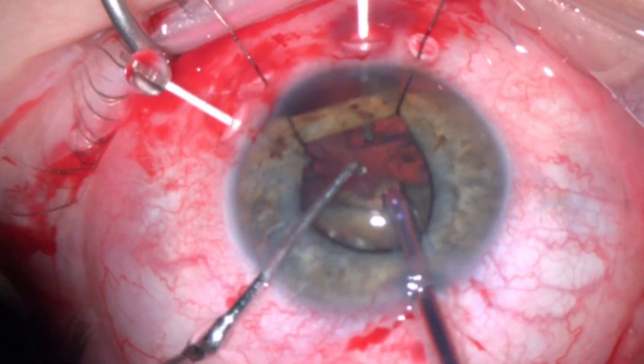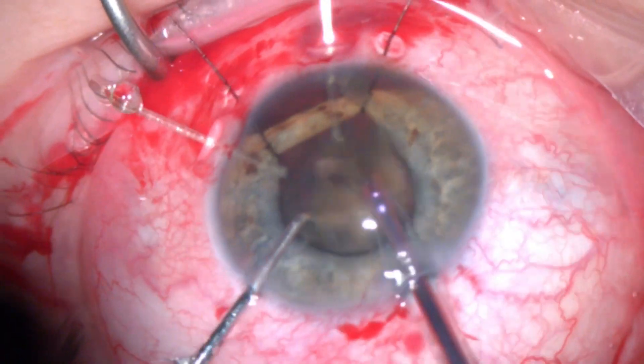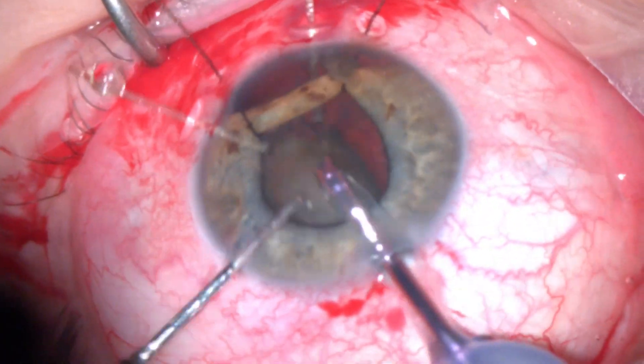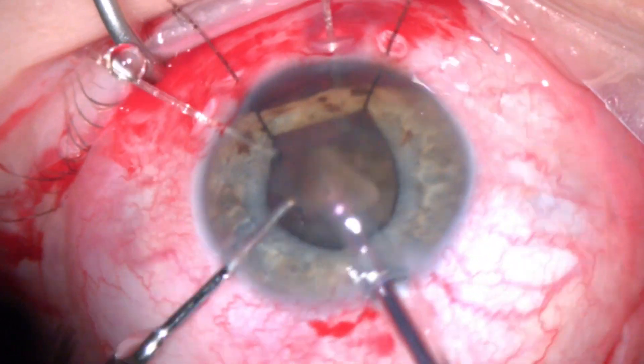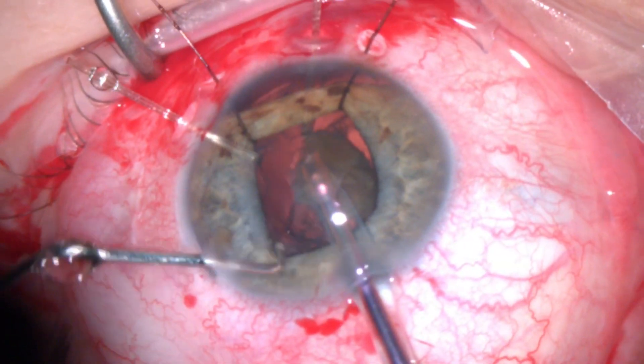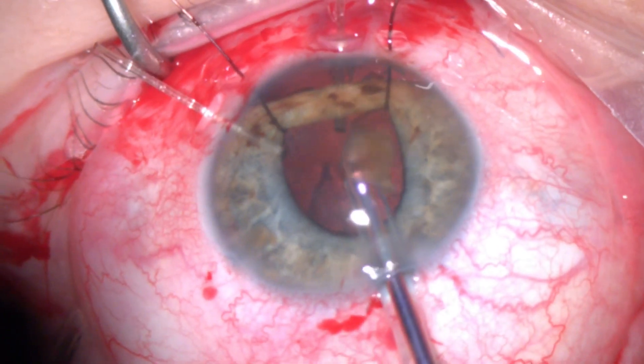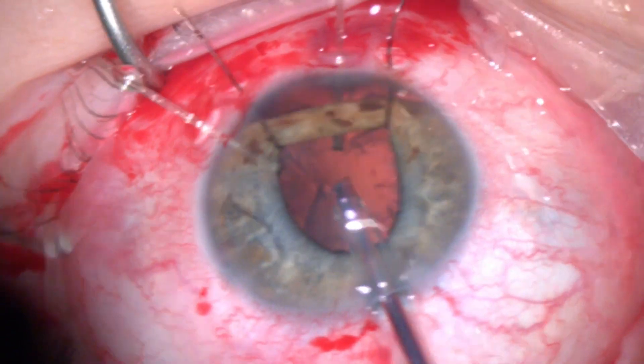I tried to keep the phaco tip in the center as much as I can, trying to chop it slightly outside the bag for the remaining fragments. The lens was quite dense and required multiple chops before we were able to completely remove it.